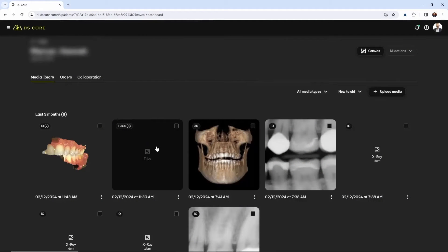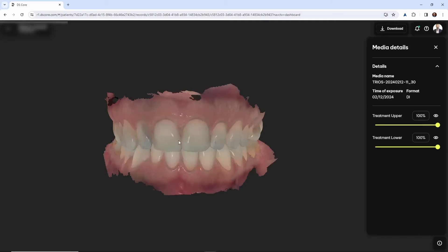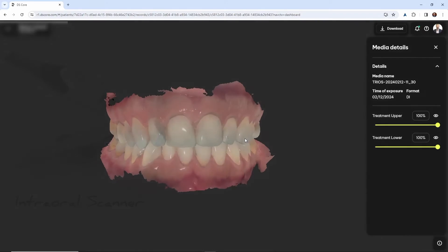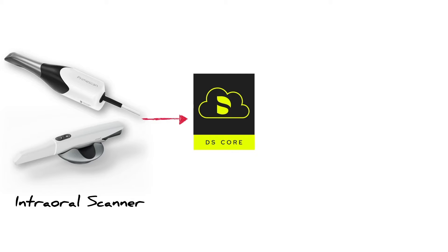Within seconds, the scan is synced to the patient's chart, and it's going to be accessible via Google Chrome. From here, you can view the scan with a patient anywhere, you can share it with anybody, and it's all automatic. Once the scan's in DSCore, you can also start a manufacturing process with the in-lab software.